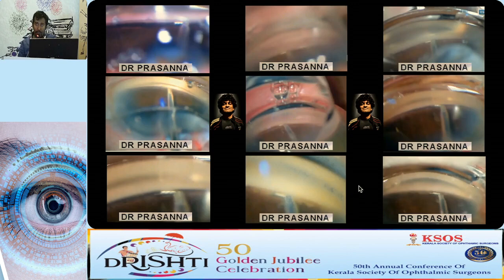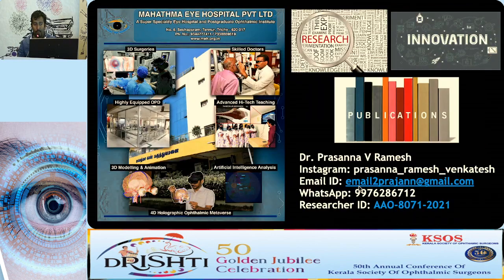And once you put that app on your phone, through the camera you can see the virtual models in front of you. You can move the camera and go all around it. You can zoom into the angle, and you can move around, look at the fundus also, because he has placed fundus images also in that virtual eye. So I think for the next 5 minutes, those who want to try out the metaverse can do so.